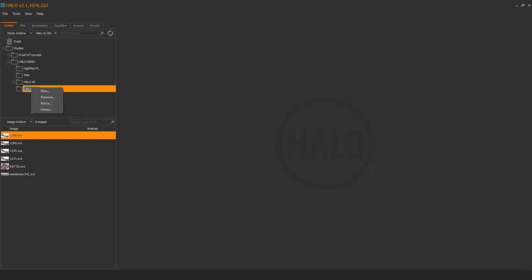So you can edit these study folders here. But if you have a large number of users, then I would make use of the searching function. So if, for example, your name is Anne and you name your study folder Anne, if you put a search in here, you'll bring up all study folders with that key term in the title. So this could be a good way to search. We can also sort as well. I didn't show these drop downs. New to old, old to new, A to Z, or Z to A.